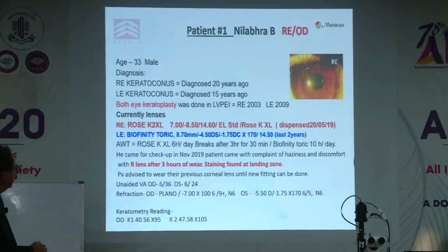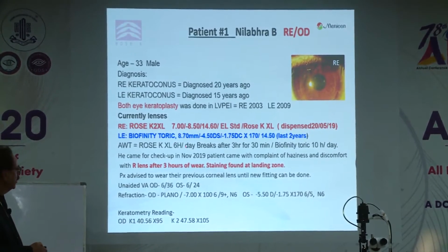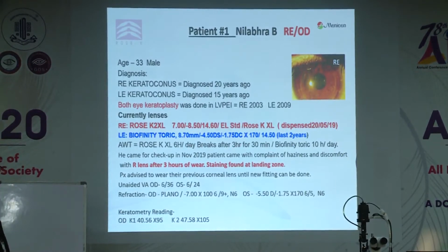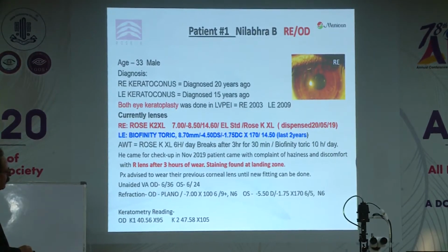Monica tried a Rose K2 XL, which is dispensed here, but he's having some issues. He wears it 6 hours a day, but takes breaks only after 3 hours, for 30 minutes. So we want to see if we can actually improve that fit. Right lens, after 3 hours of wear, staining was found.